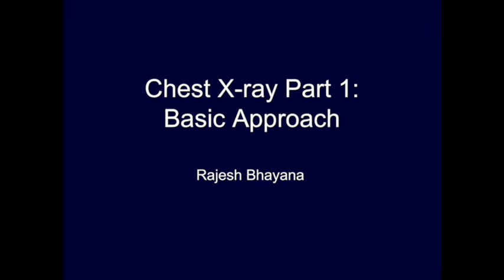This video is an introductory video designed to give you a solid, systematic approach to chest x-rays. In part 2, we're going to practice applying this approach by looking at a few illustrative cases of common things that you're going to see and things that you shouldn't miss.